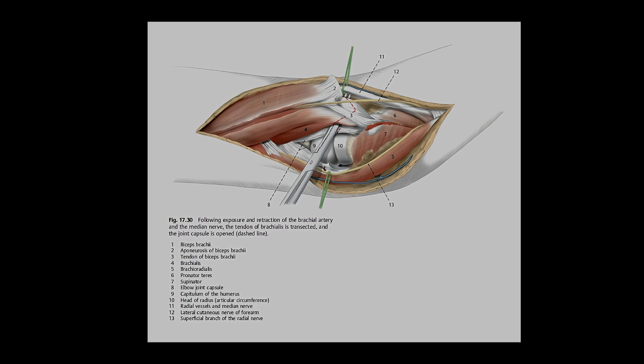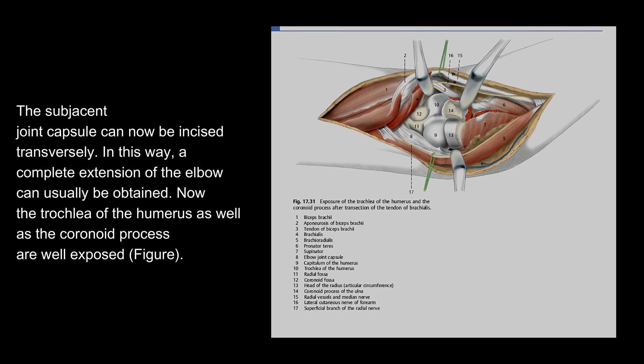The subjacent joint capsule can now be incised transversely. In this way, complete extension of the elbow can usually be obtained. The trochlea of the humerus as well as the coronoid process are well exposed.